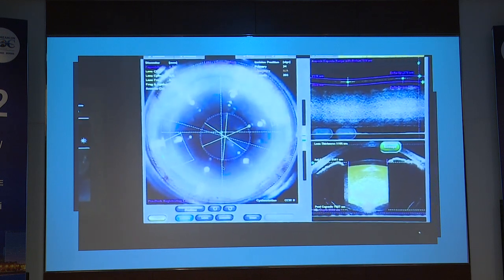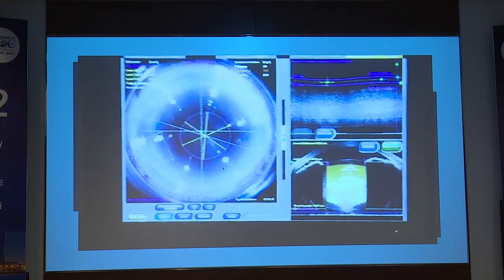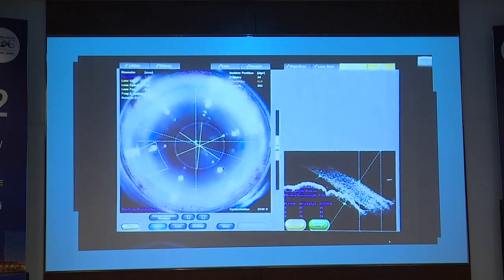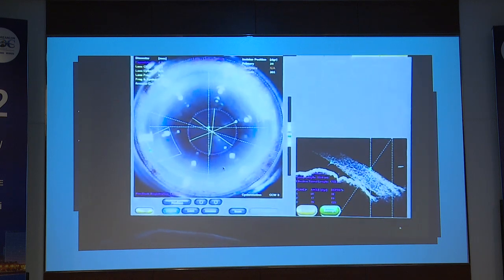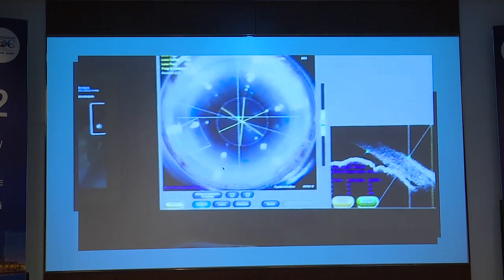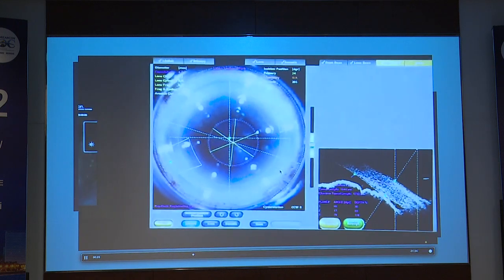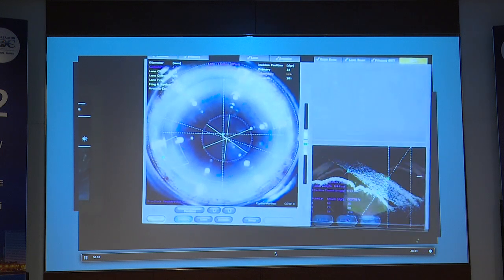This is a case where I would say femto can help you, because if you have a rhexis good enough, you can go ahead and you have a nuclear plate which is broken and fragmented. Look at the side, if you can see the anterior chamber is just not there at the periphery. The iris is touching the cornea. There is hardly any place for you to work. So, go ahead and adjust, and as you do that, it will help you on a femto.